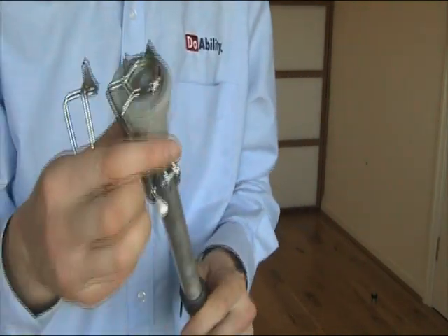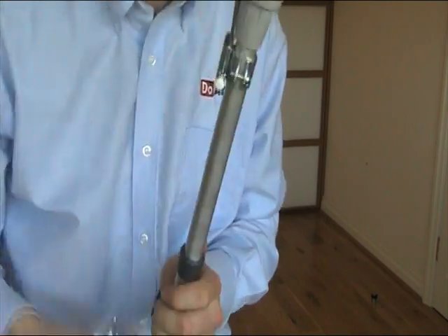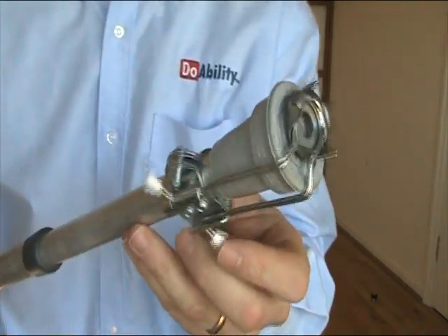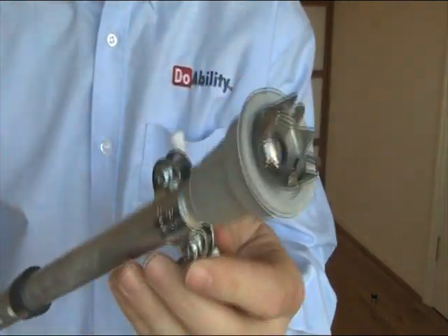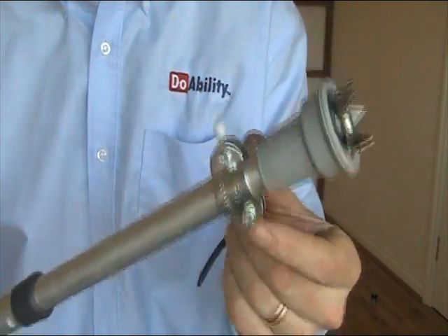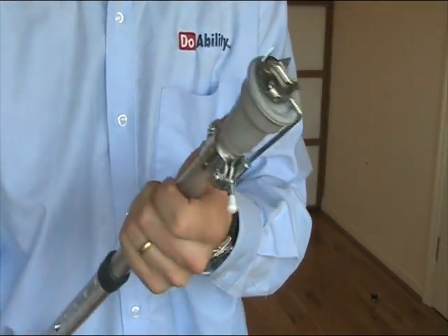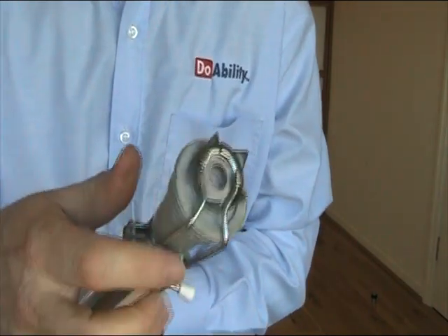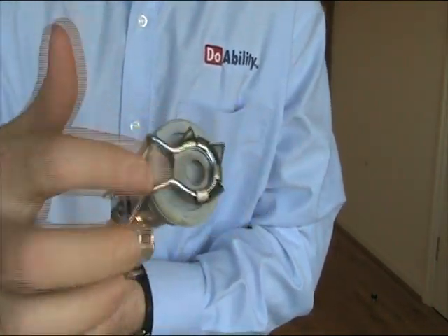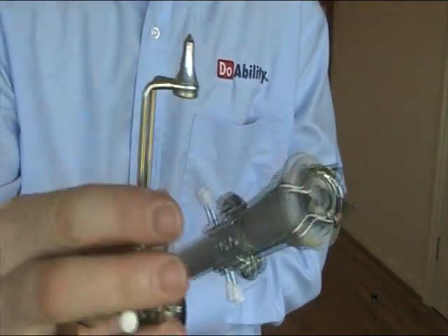We've got the crown type of ice spike which fits onto the end of a crutch or a cane like this. There's a clamp with two screws — you just take one of the screws out and it's quite easy to fit onto the bottom of your crutch or cane. This one is called the crown; it's got a crown shape on the bottom, which is why it's called the crown.